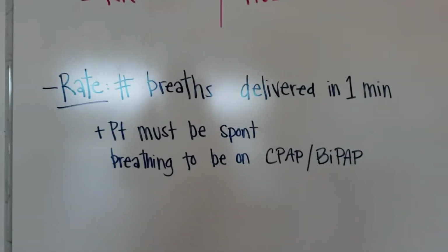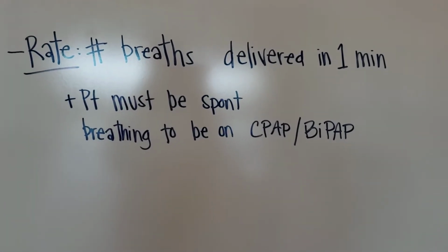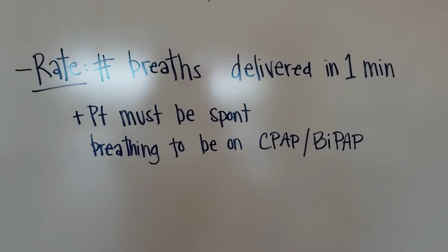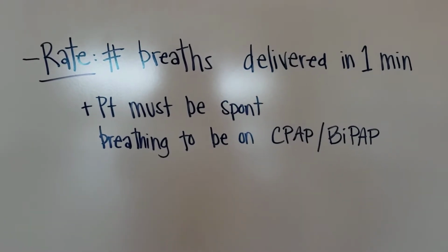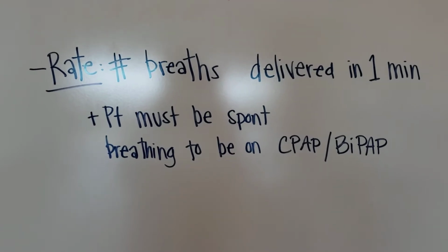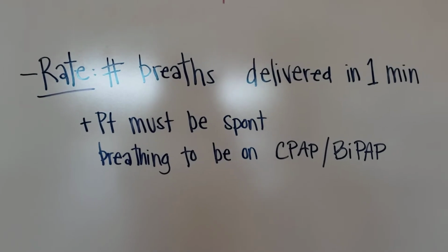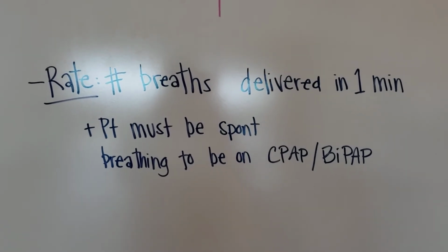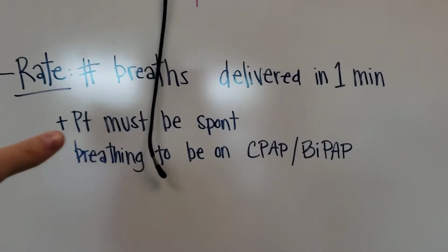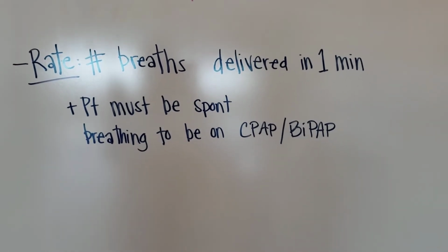So with rate, you can set a rate on BiPAP, which is the number of breaths delivered in 1 minute. One requirement to be on a non-invasive BiPAP is the patient must be spontaneously breathing, otherwise they need to be intubated in order to support an adequate respiratory rate to keep your patient alive. So this is the total number of breaths delivered in 1 minute.